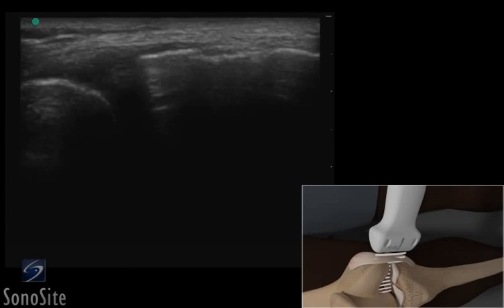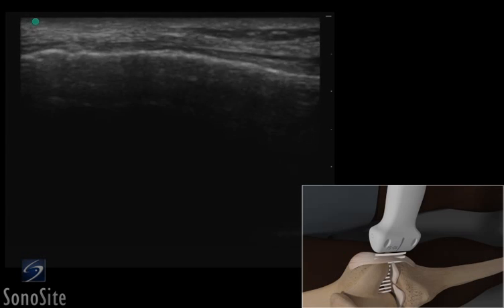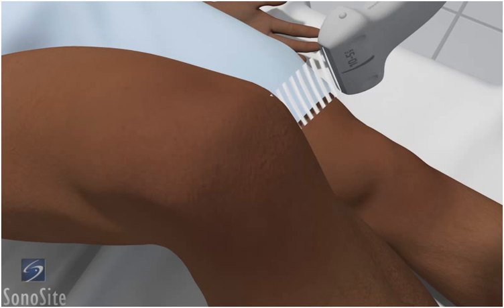A linear array transducer with a musculoskeletal exam type is used to perform an ultrasound-guided injection of the medial collateral ligament of the knee. The patient is in a supine position with the knee flexed 90 degrees.